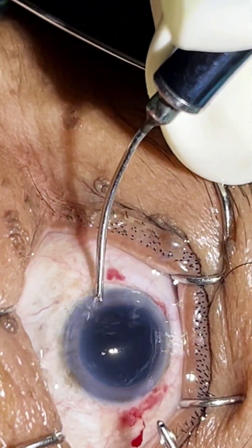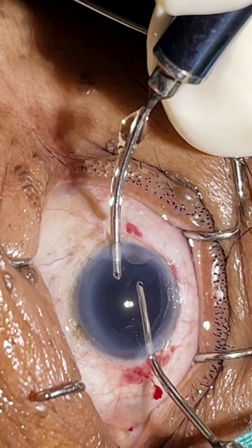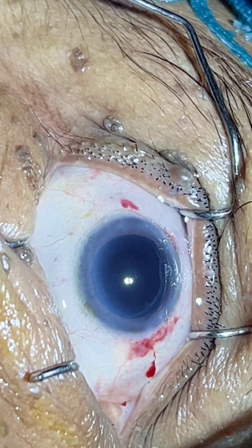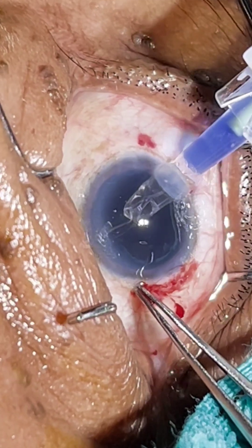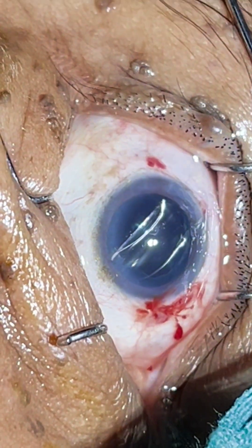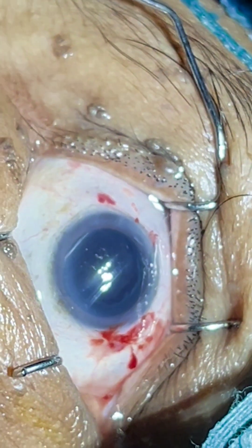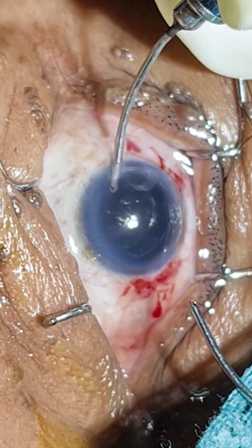If we inject it nicely, it directly slips into the capsule like that — we don't have to again dial. I will just tap it to see how nicely it slipped in and fixed in the capsule. Now we will just spread the residual viscoelastic.